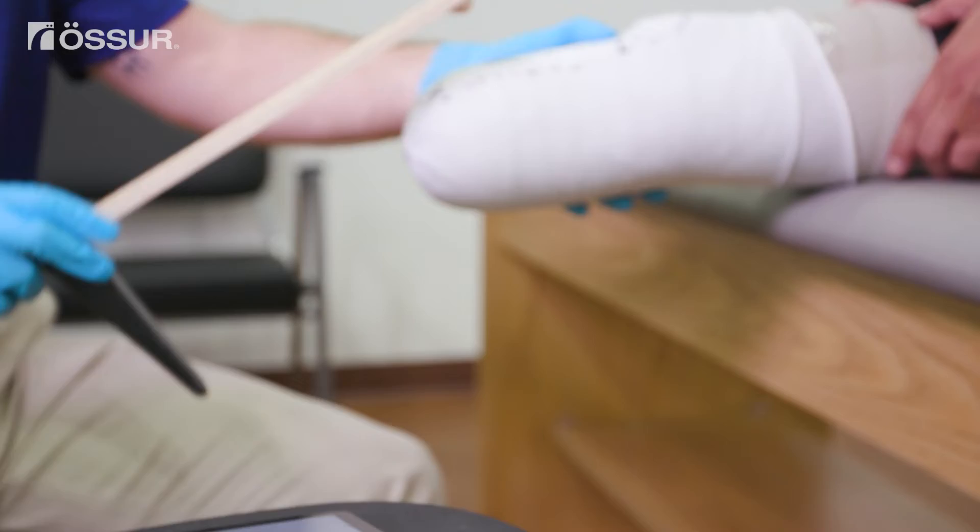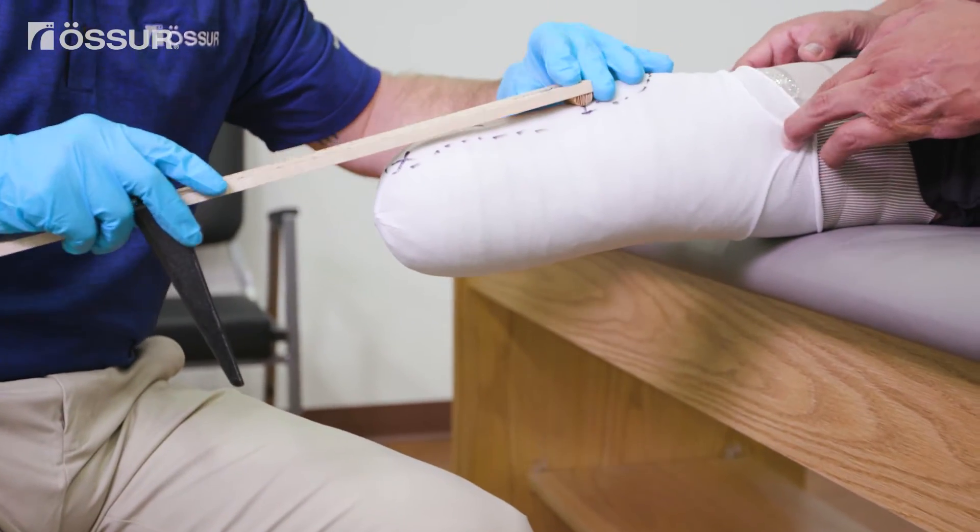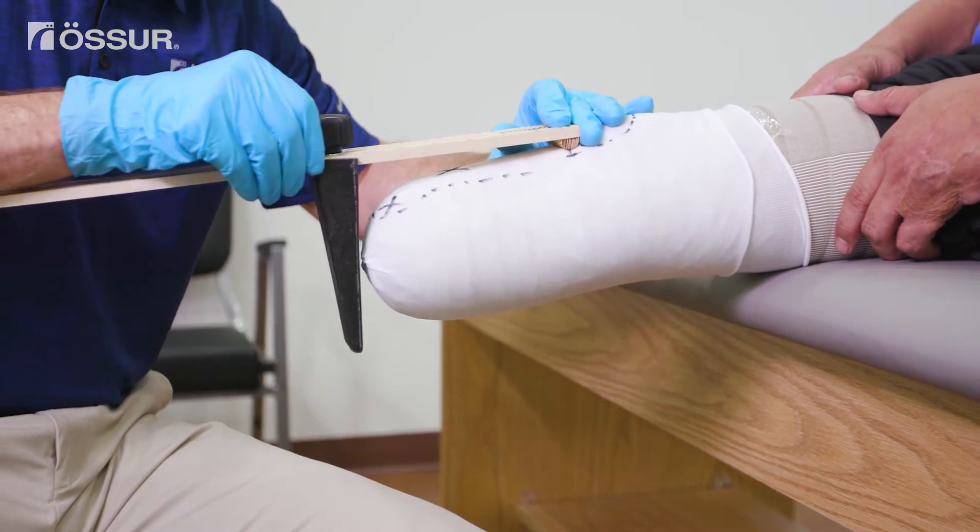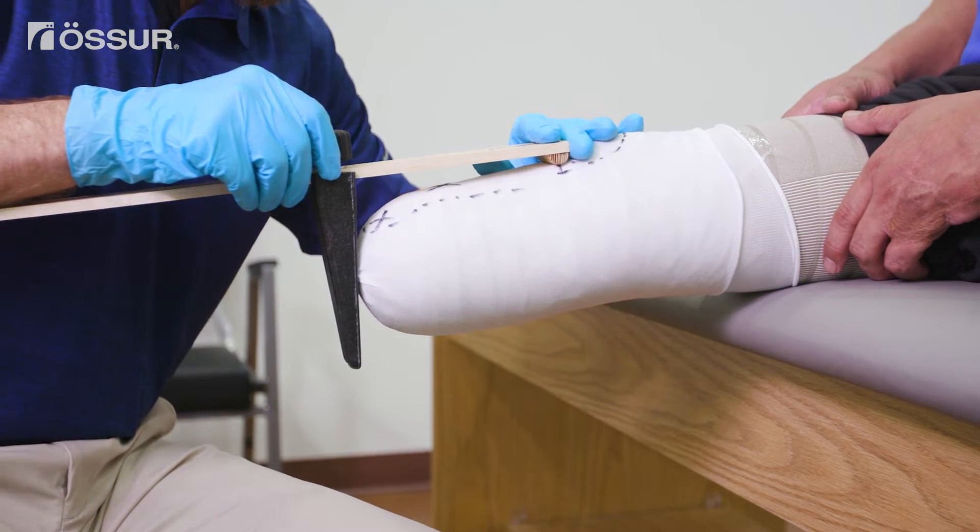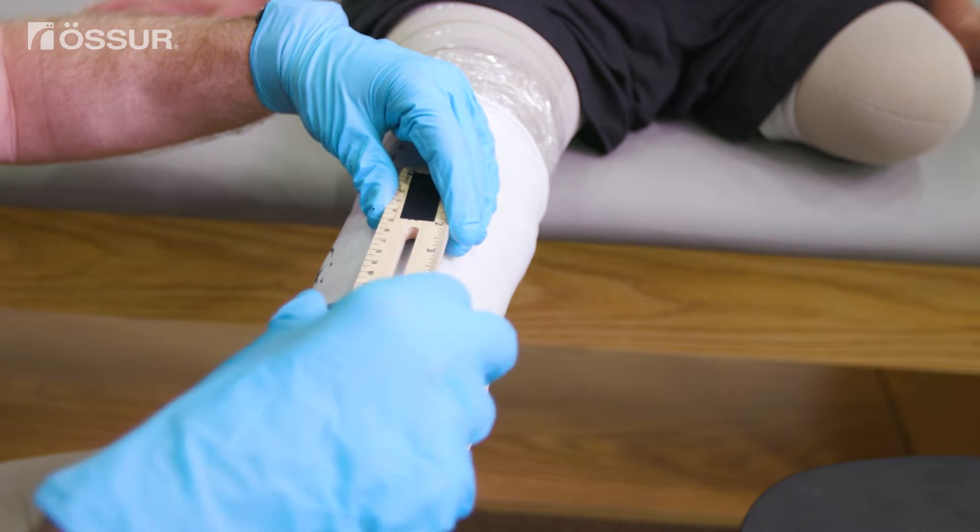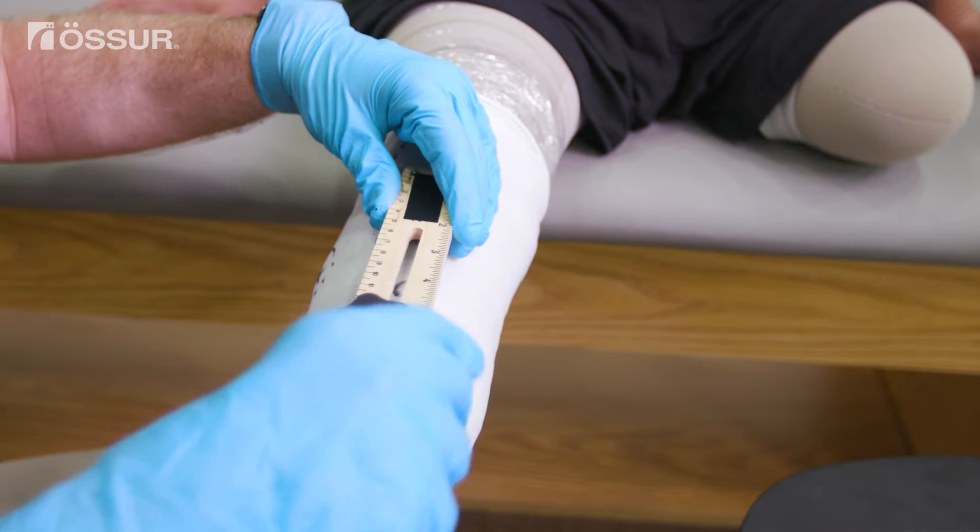Let's start by measuring the length of the residual limb. Using a length gauge or hard measurement stick, first place one end of the length gauge even with the mid-patellar tendon. Then measure down to a point even with the distal end without compression.